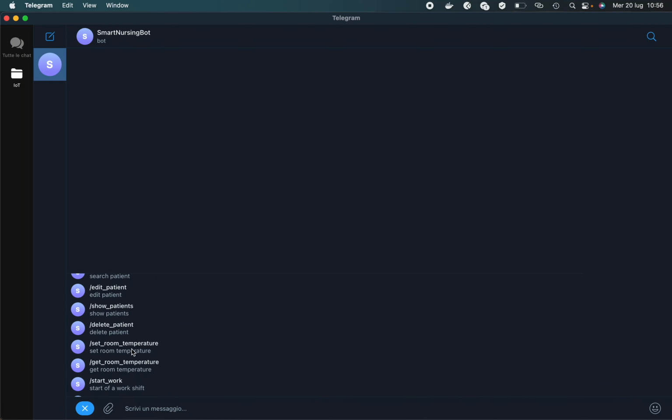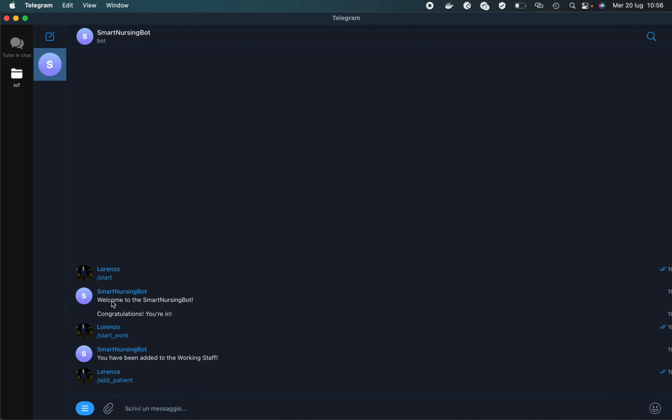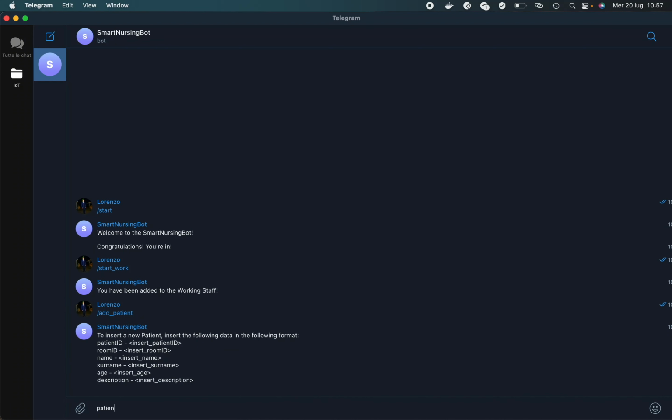As already said, the doctor can add a patient by inserting the data, or can do several other operations, like searching for a patient. Now I will add a patient and then I will search for this patient by his ID.